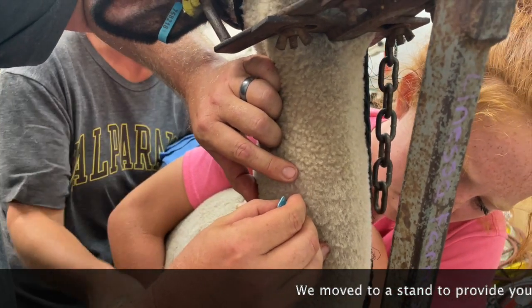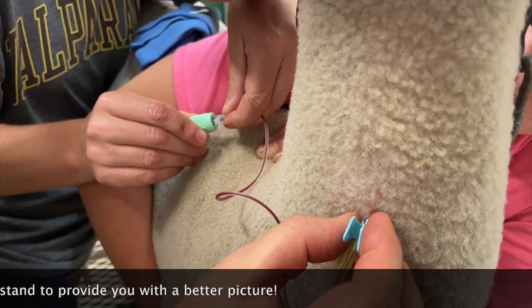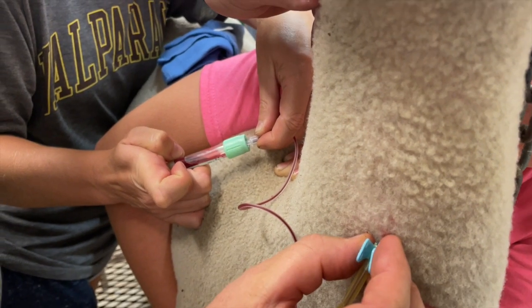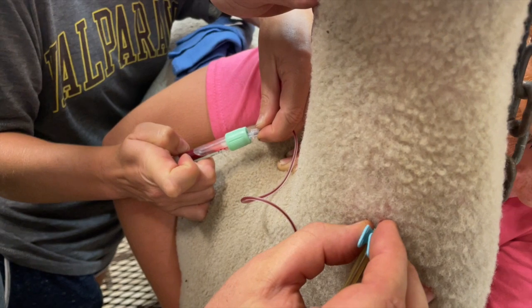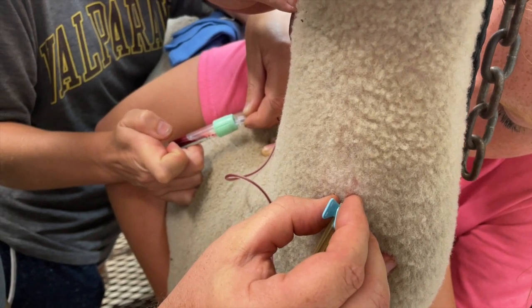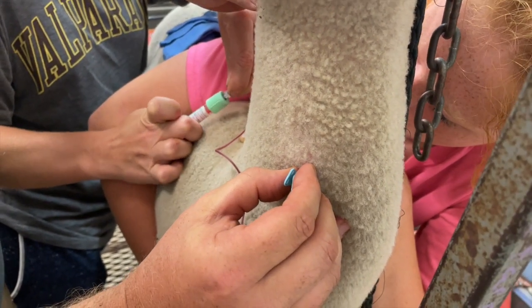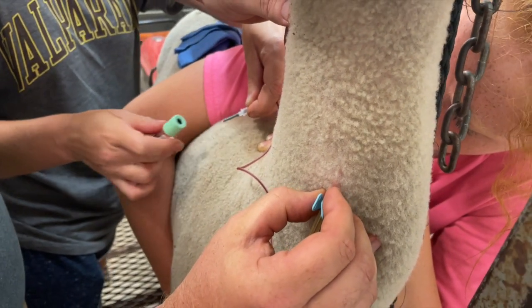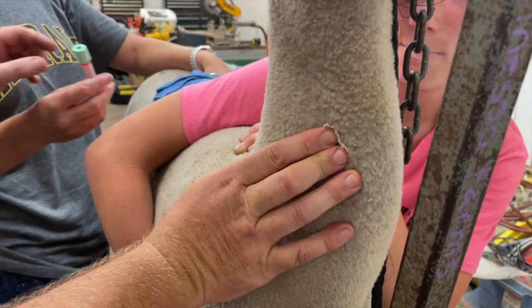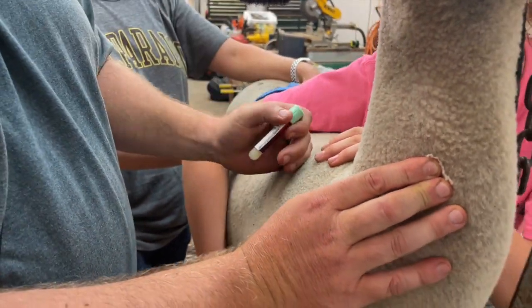Go ahead and hook up my tube for me. If you come up and over my finger, you can see that flash in there — and now Jocelyn's drawing that in. You feel a pretty good-sized pop when you get into it, and you can see it's going in. Jocelyn's filling up the tube. Sometimes you've got to manually manipulate them around a little bit to get them to fill up appropriately. Get as much as you can and then call it good. Pretty comfortable for her — she's doing okay. So I'm going to go ahead and withdraw, take some gauze, hold pressure. I've got my tube with my blood sample in there, and I can mail this off to my lab and we are good to go.